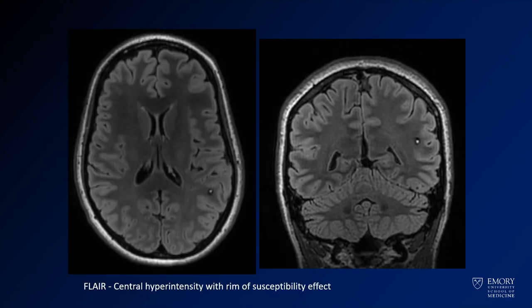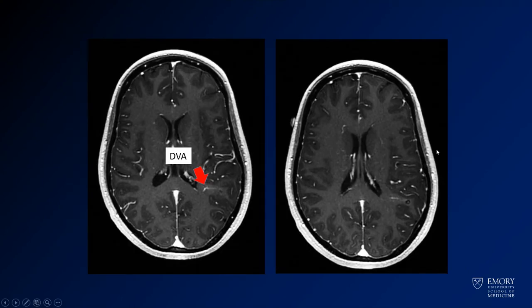Here you see the FLAIR images: on the left inferior frontal lobe there is this lesion that is centrally T2 hyperintense with a rim of dark signal on T2, which represents susceptibility from old blood products or hemosiderin. You see the same thing on the coronal image. On the post-contrast image, there is a branching linear area of enhancement — that's the developmental venous anomaly associated with this lesion — which strengthens our diagnosis that this is a cavernoma.